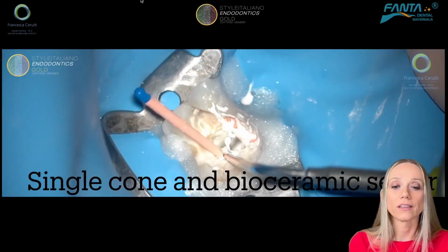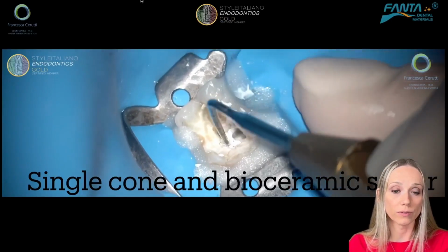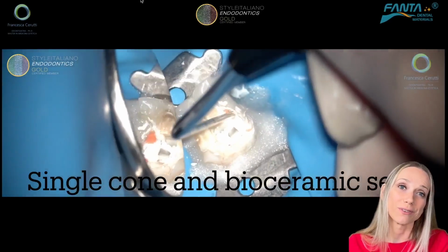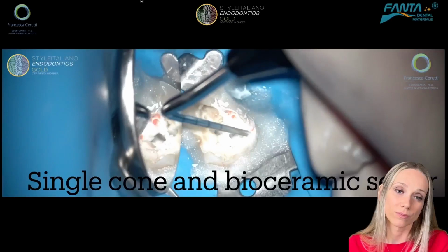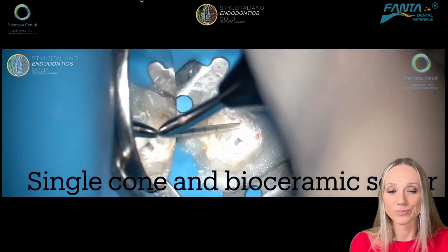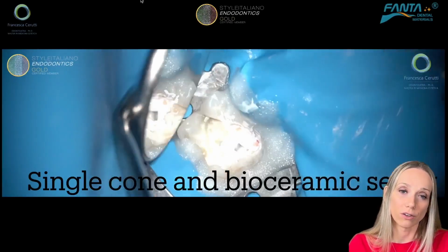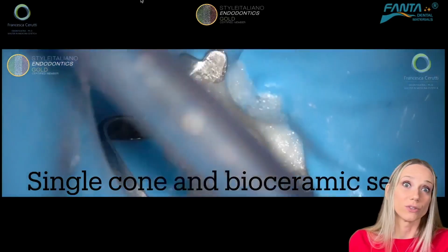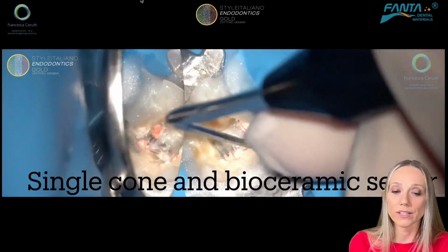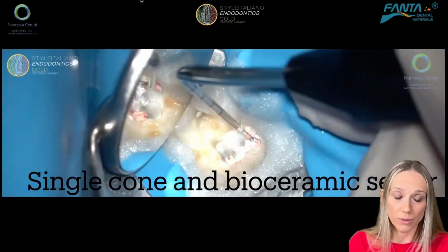And then with my heat carrier, I'm going to just cut the part of the gutta-percha point that extrudes from the root canal opening. And then I take my plugger and just pack the gutta-percha, which, having been warmed, has become soft. And so it can adapt to the shape of the root canal. I finish packing. I use the bigger part of my plugger, obviously, because I'm in the coronal third. And then with just water and air, I rinse and I try to remove the excesses of the calcium silicate based sealer.